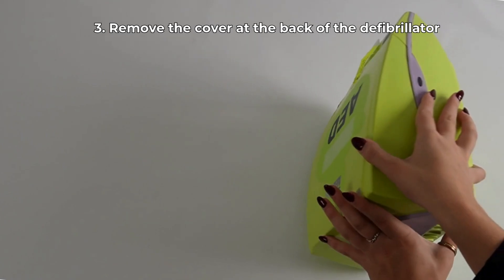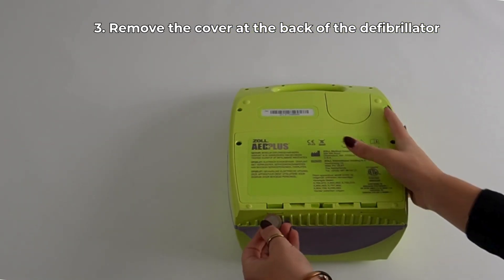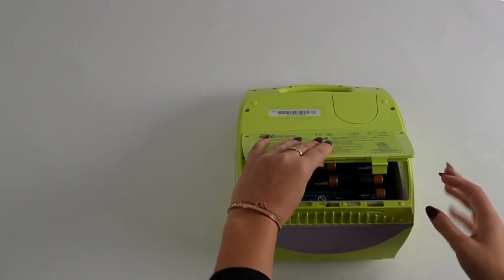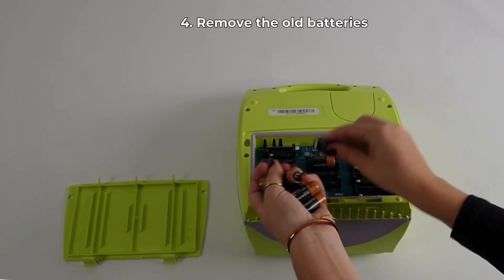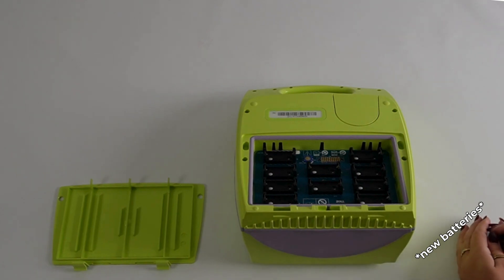To replace the batteries, first remove the cover at the back of the defibrillator. This can be done using a coin. Then remove the old batteries and replace them with new batteries.